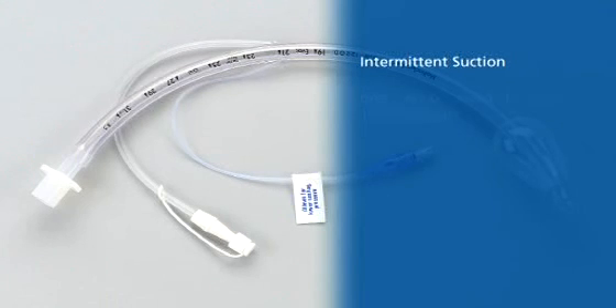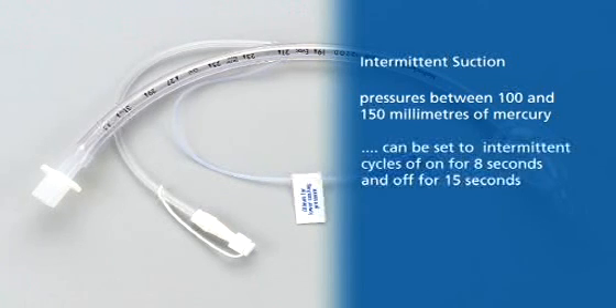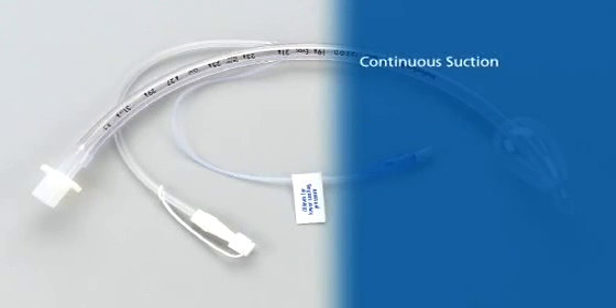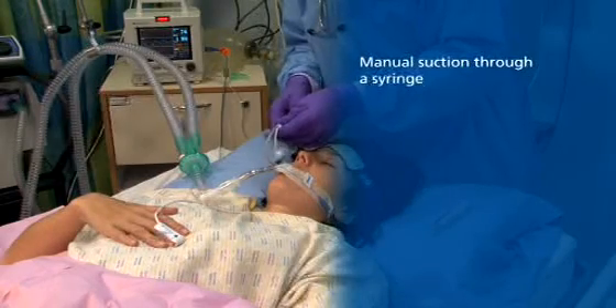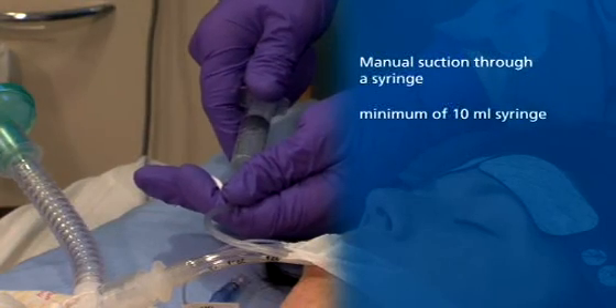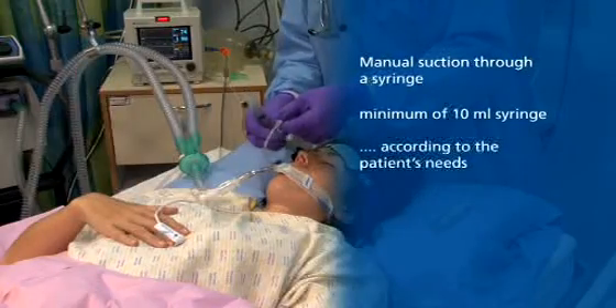Intermittent suctioning can be applied using pressures between 100 and 150 mmHg and can be set to intermittent cycles of on for 8 seconds, off for 15 seconds. Continuous suctioning can be applied with pressures not exceeding 20 mmHg. Please see the instructions for use for further guidance. Manual suction can be facilitated using a minimum of a 10 ml syringe and should be applied only in accordance with the patient's clinical needs.